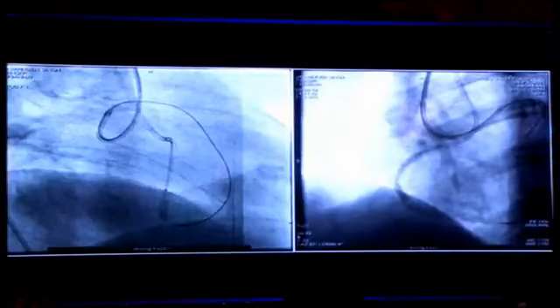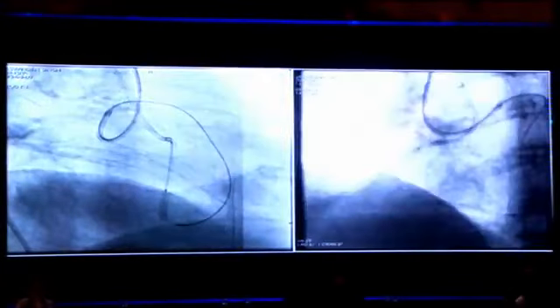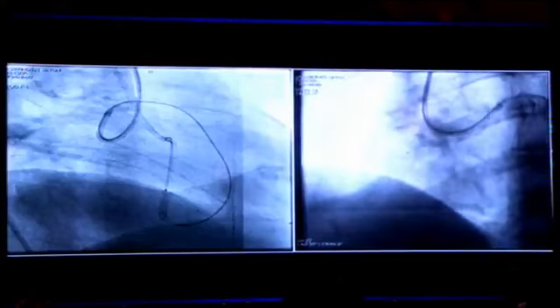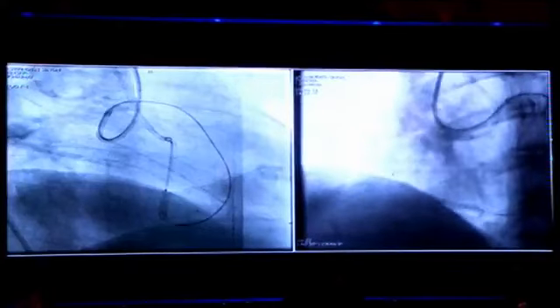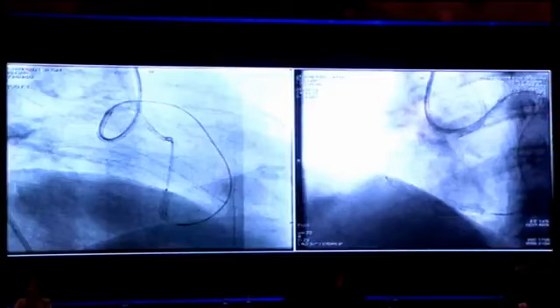So now we try to get to the crux with a stent balloon. Is it deflated? Yeah, deflated. To move this forward might be difficult. Hello, are you able to hear? Yeah. We just left at this stage.